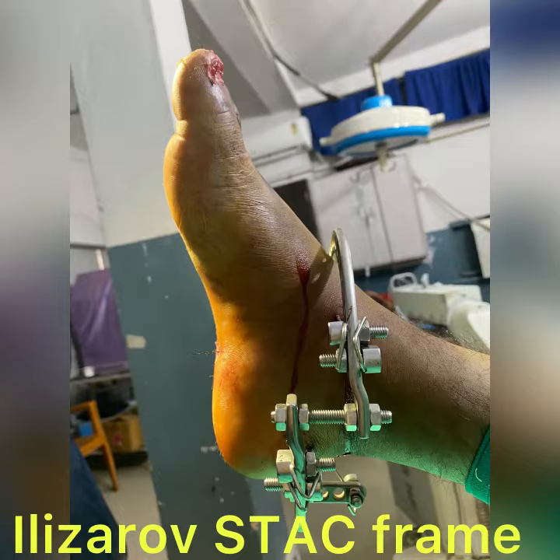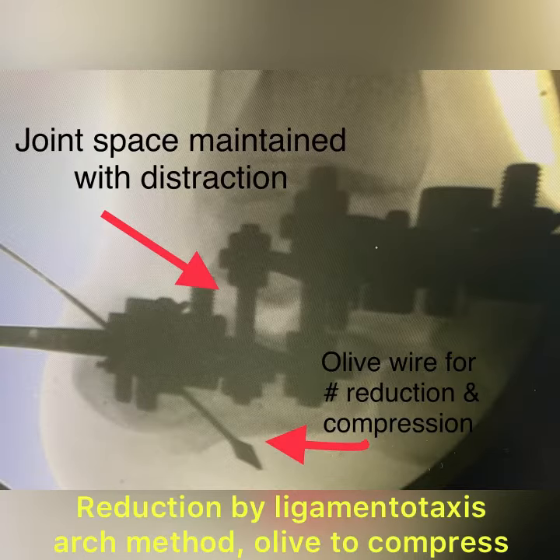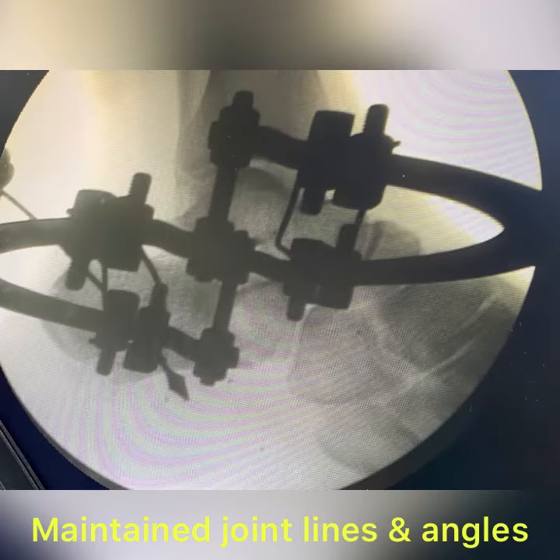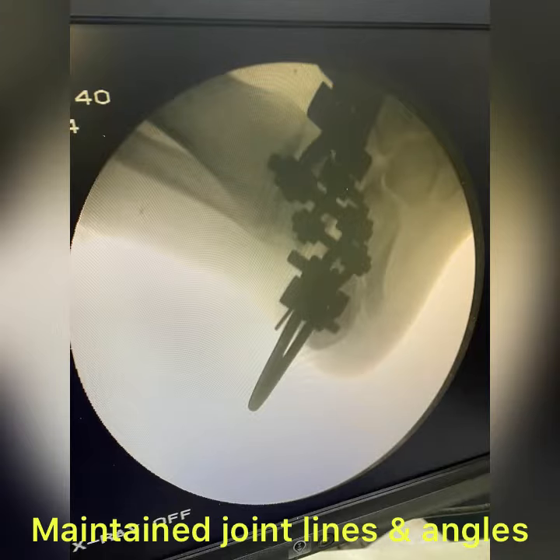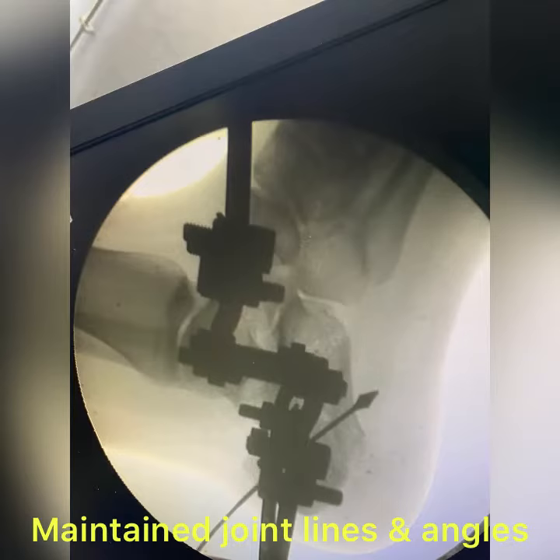Here in the x-ray you can see the joint line has been well maintained with the distraction with the nuts. Wires were used for fracture compression. Joint lines can be clearly seen and all the angles are well maintained in this case. These are the different x-rays for this. This is a dynamic frame where this is an olive for the compression of the fracture.